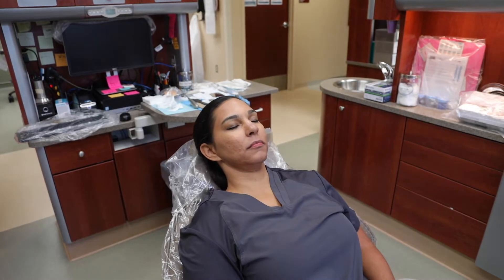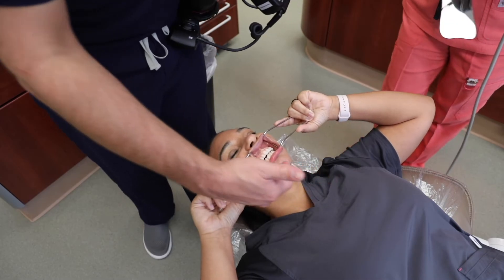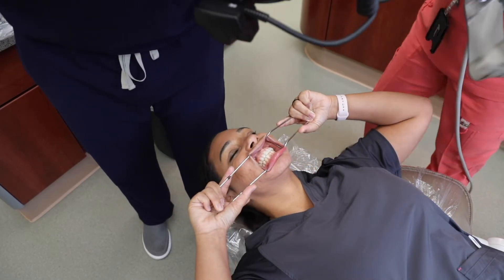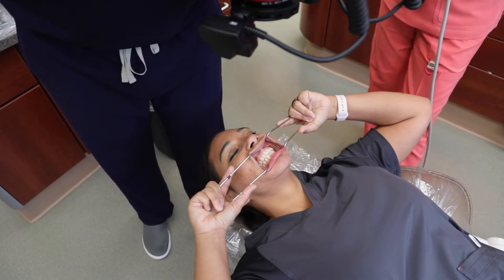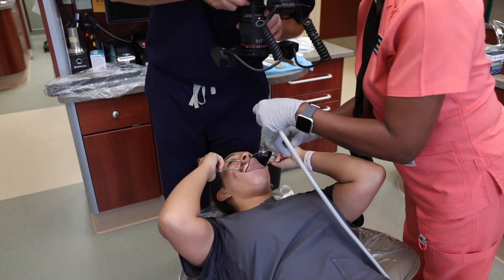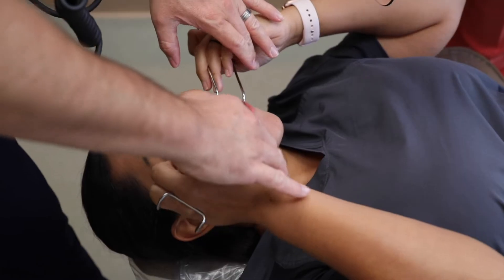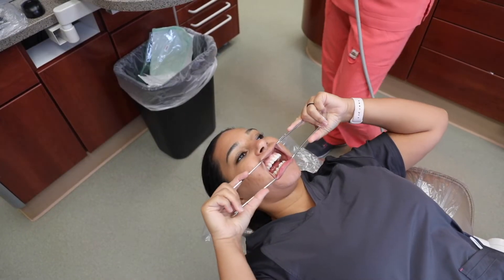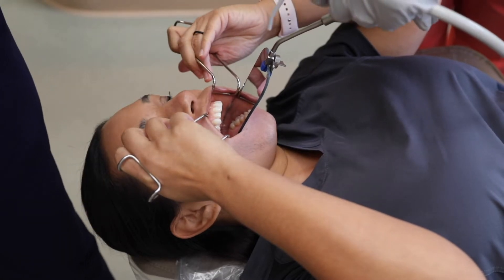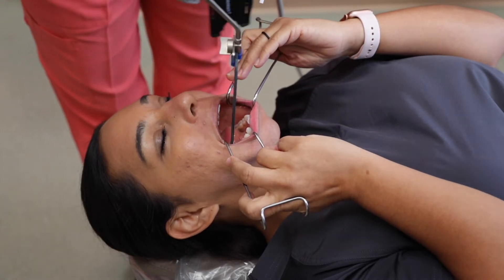For all the intraoral photos I have the patient lying back in the chair in a supine position. I like to have the patient raise their chin in the air so their mouth is pointed more towards me, where I am standing at the 12 o'clock position of the dental chair. These images require the patient to use retractors to pull the lips and cheeks off the teeth — out and forward. When shooting maxillary shots they pull out, forward, and upward. For mandibular photos they pull outward, forward, and downward.